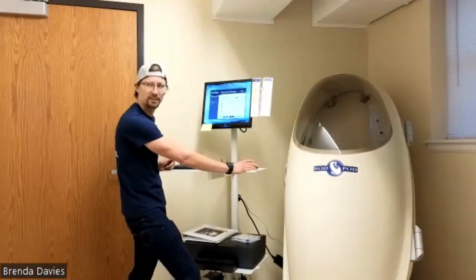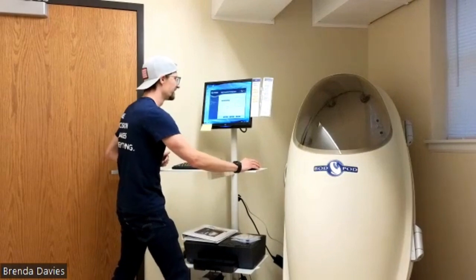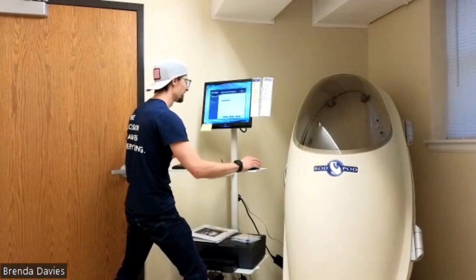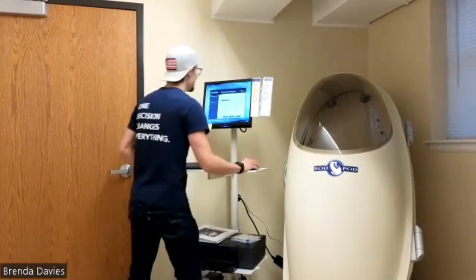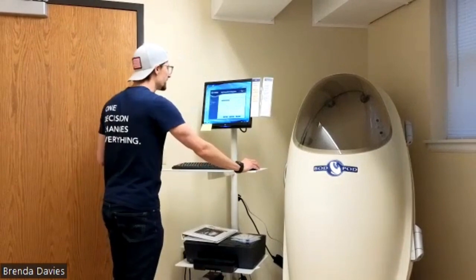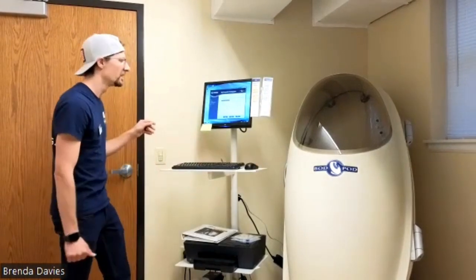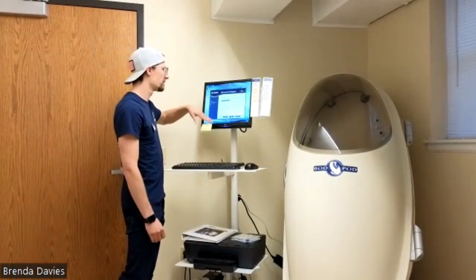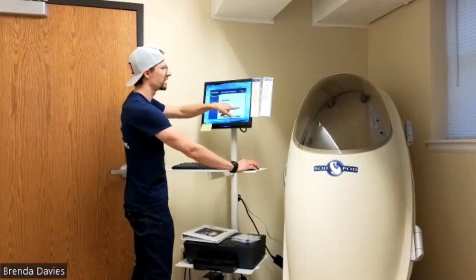What was your birthday? Just want to make sure that you're the right person. I'm going to change the actual measure to 67. Since you've already been here, you don't have to put in all the information, but if this was a first time individual, you would have to put in their name, their date of birth, their gender, and their height. And then there's also an ethnicity piece.